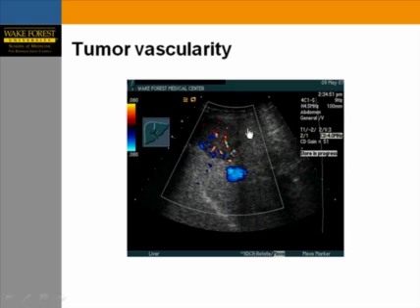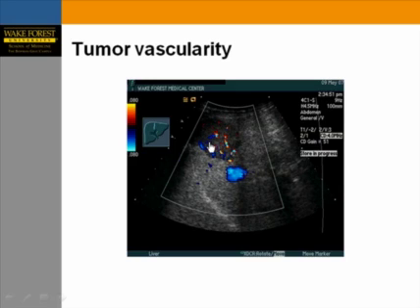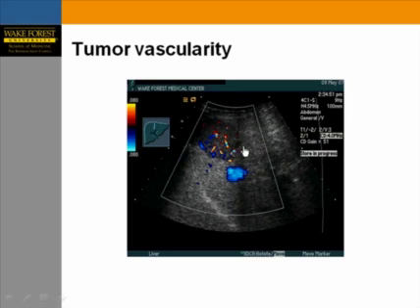Another example of a liver mass showing a spoke-wheel pattern, which is typical of focal nodular hyperplasia.